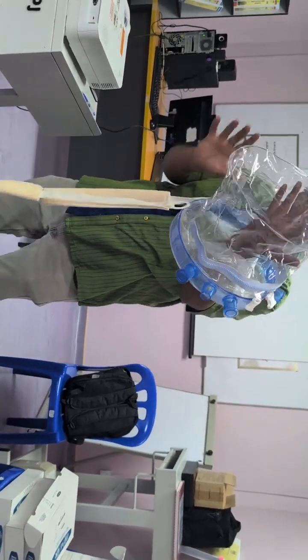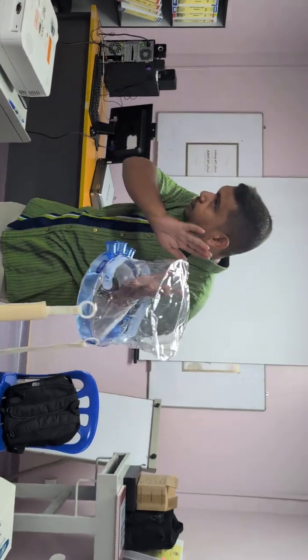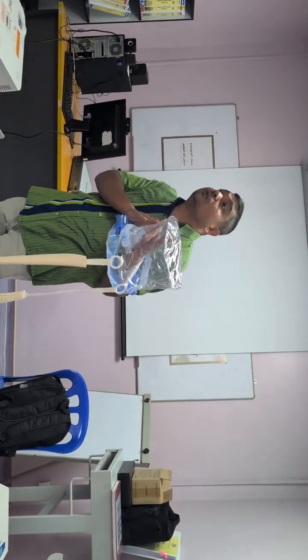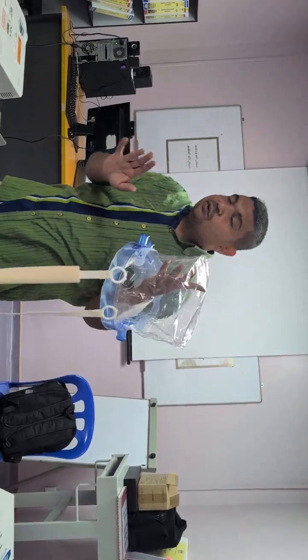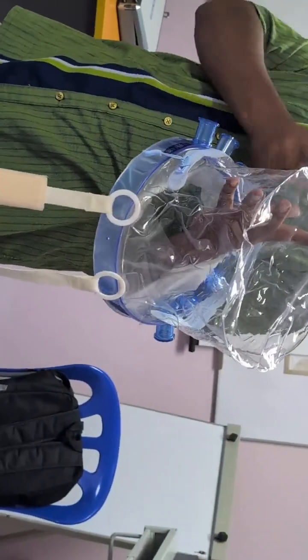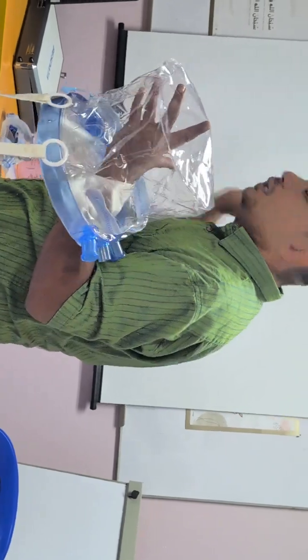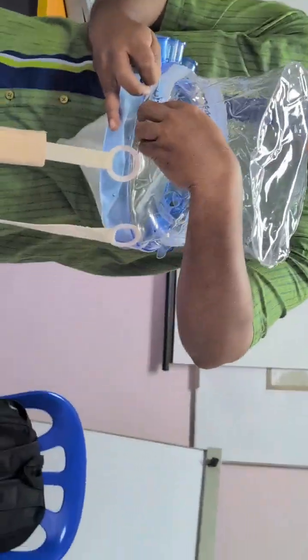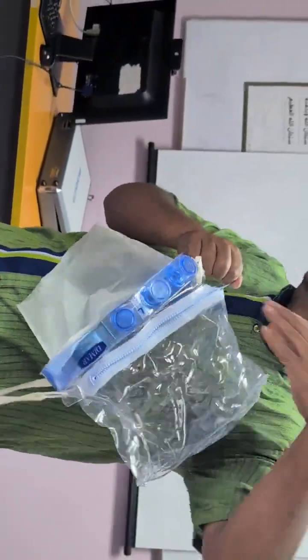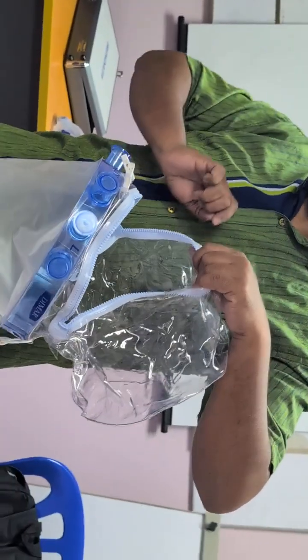Alright? If you want to feed the patient, because this is not suitable for pre-hospital care or the emergency use. Not suitable. This is more for ICU. Okay? If you want to feed the patient, because a patient on this mask is a patient who is conscious. Right? The patient wants to eat, wants to drink. All you need to do is, don't touch your ventilator. Give him food, give him drink, whatever he wants to do. And then, close it back.